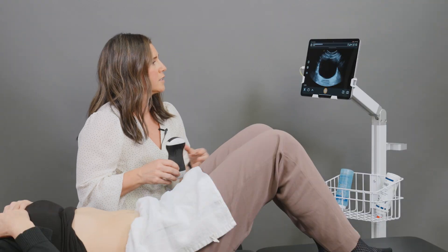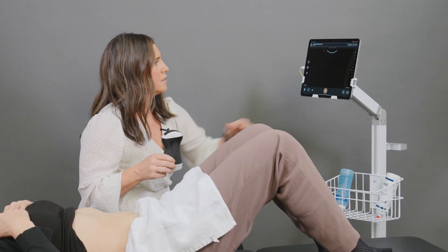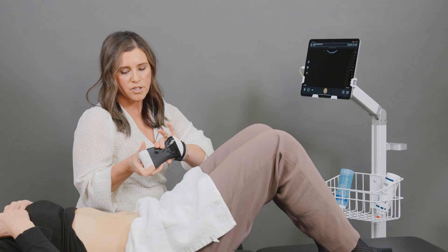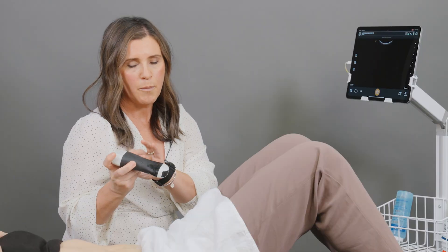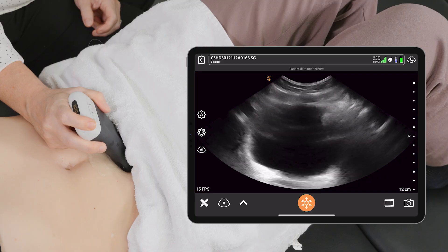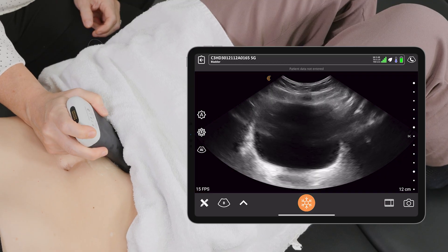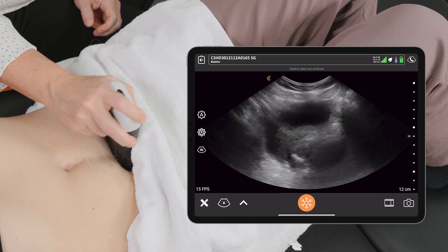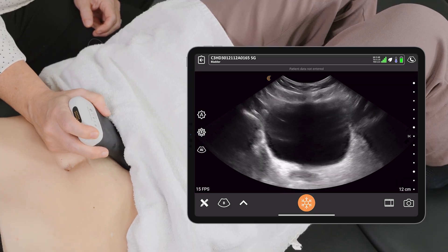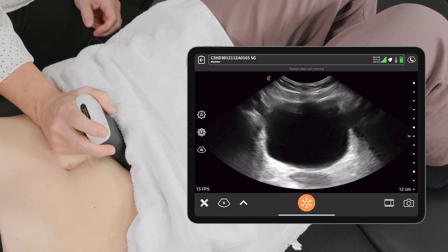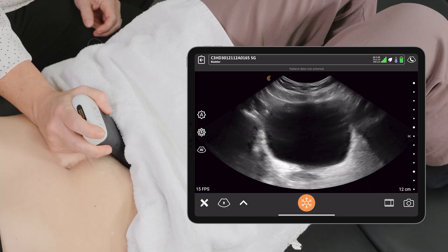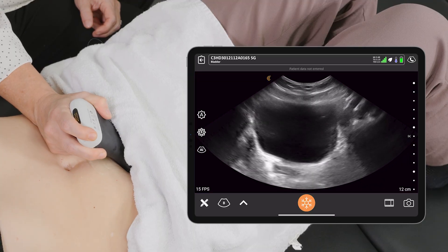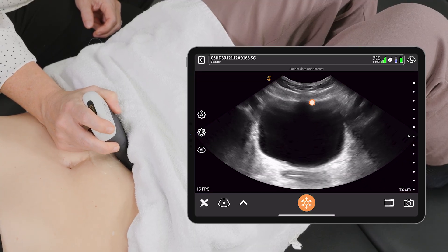We're going to come into view here. We're going to make sure that the marker of the probe is towards the patient's left, which matches the screen, and then we're trying to angle the probe down in that suprapubic region to find the best view of the bladder.